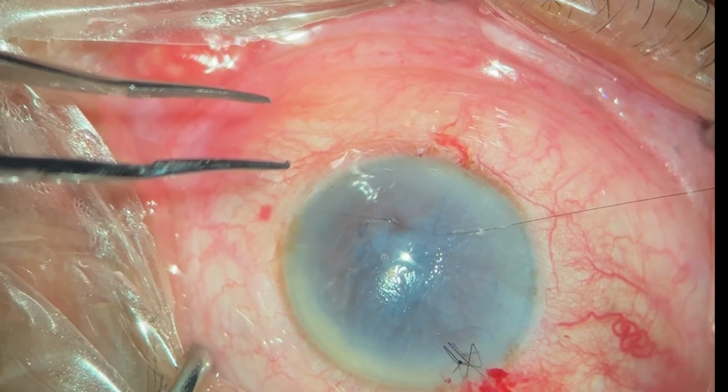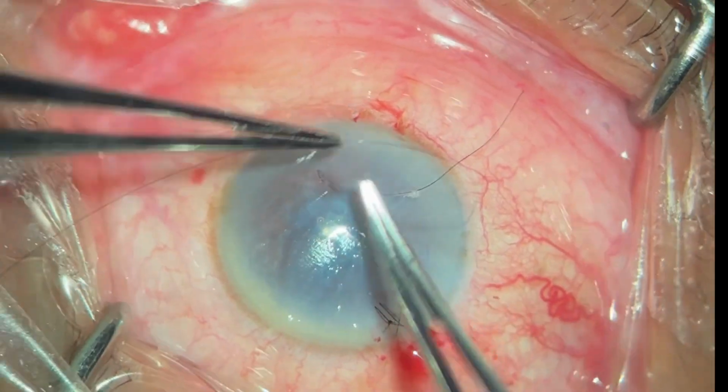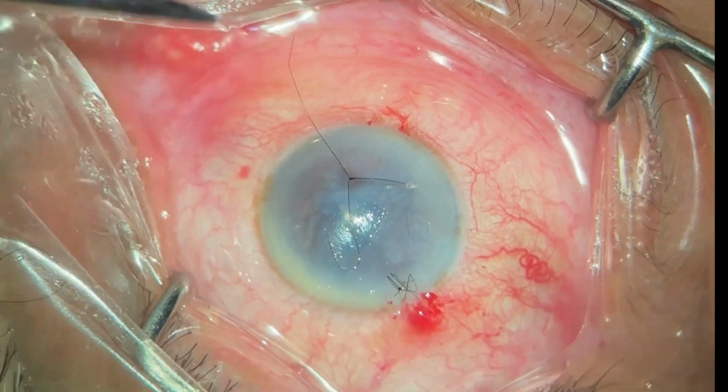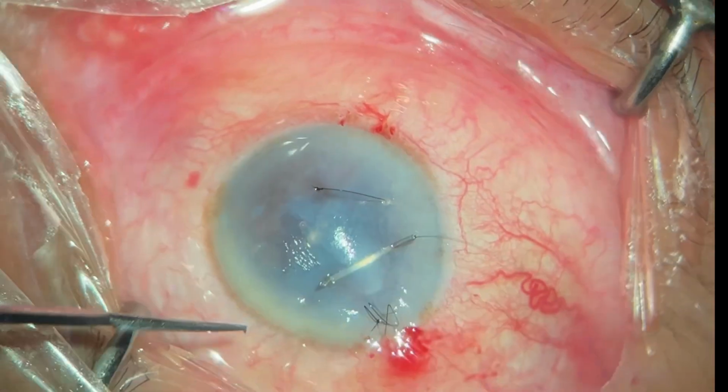So I decided to place sutures more centrally in a triangular fashion. All these sutures were taken full thickness. So the first suture was placed inferiorly, the second suture supero-nasally, and the third suture supero-temporally.